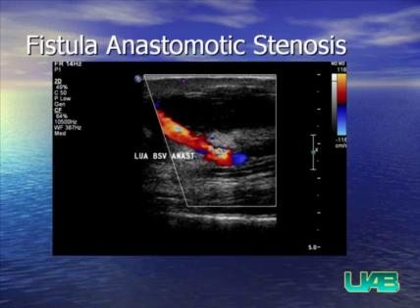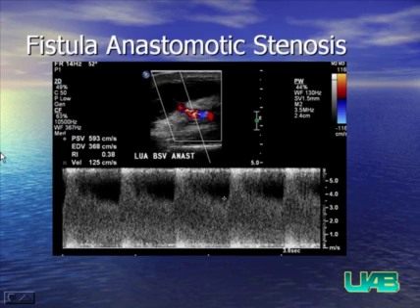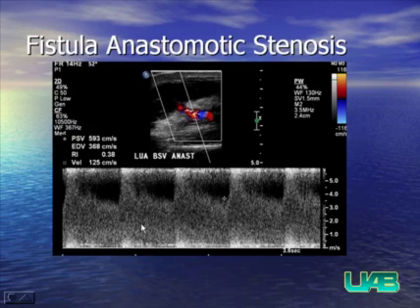This is an example of a fistula with an anastomotic stenosis. Notice the turbulent, disorganized flow in the anastomotic region. The feeding artery two centimeters from the anastomosis shows a peak systolic velocity of 123 centimeters per second. At the anastomosis, there is very turbulent flow with loss of the black window and a peak systolic velocity of 593 centimeters per second — greater than a three-to-one ratio, suggestive of anastomotic stenosis.